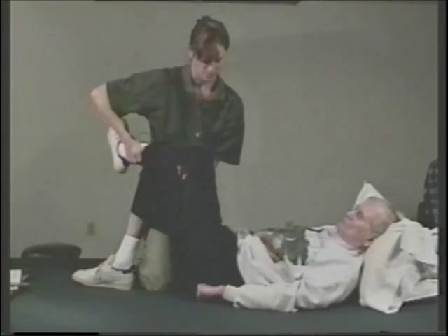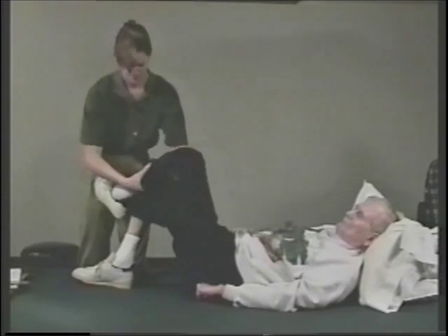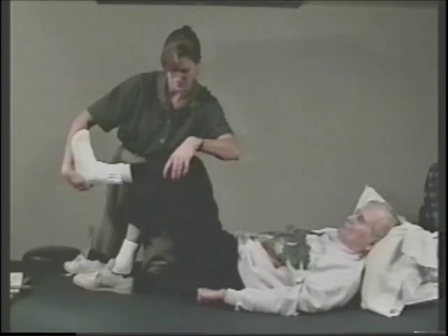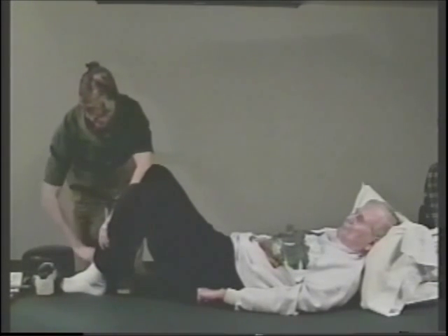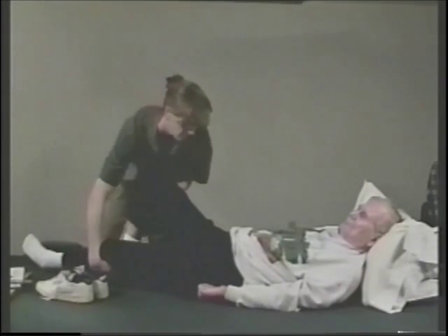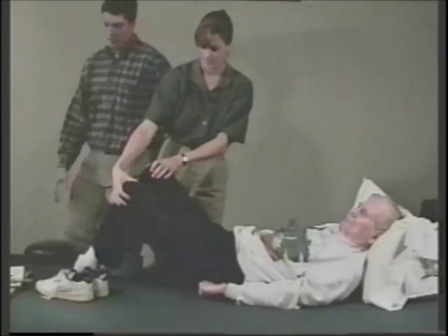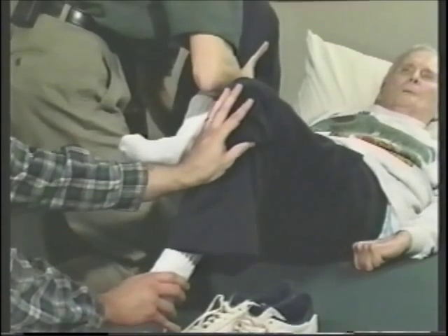He also has problems with his hip rotation. And then looking at the ankle. Go ahead and bend this knee, Jim. Bob, can you hold this knee for me? Just one hand hold there. Checking the opposite side, which has a little more range on this side.